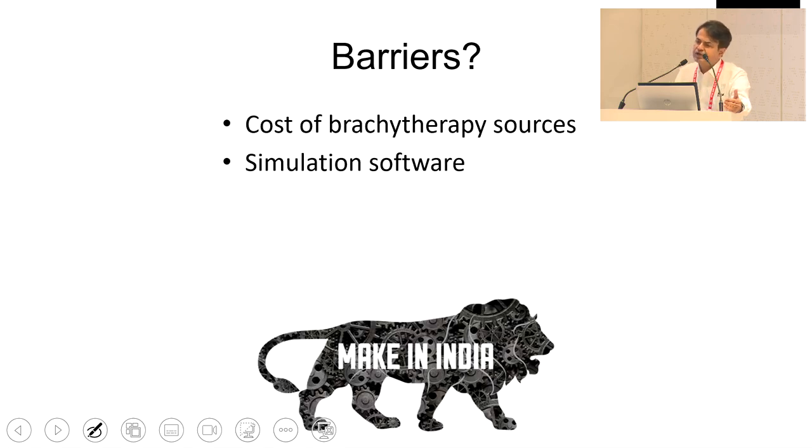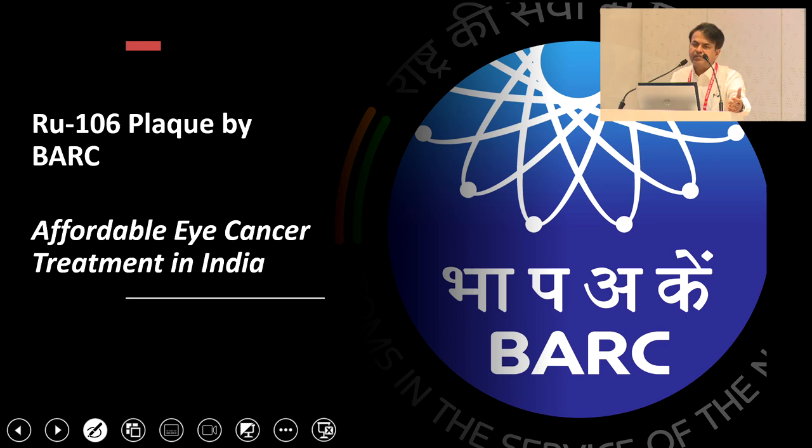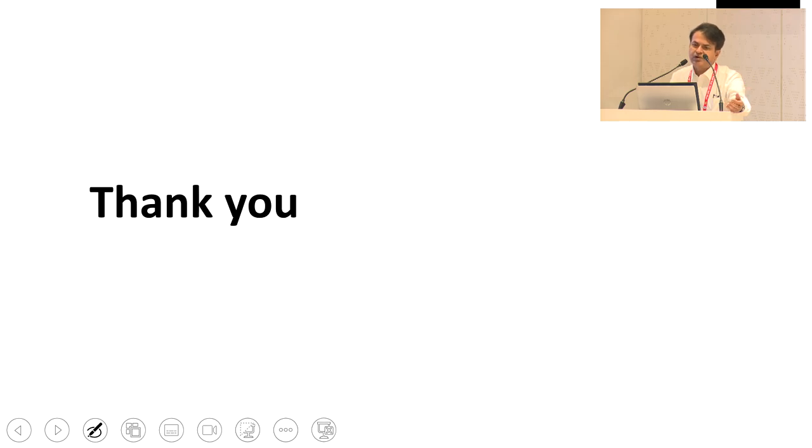The barriers so far were the cost of brachytherapy sources and the simulation software, all of which were imported. But with the Make in India plaque by BARC, with whom we collaborated, there are many designs that are available. We are currently working on newer designs to optimize the dose and delivery of plaque brachytherapy. With this, we have got much better success.